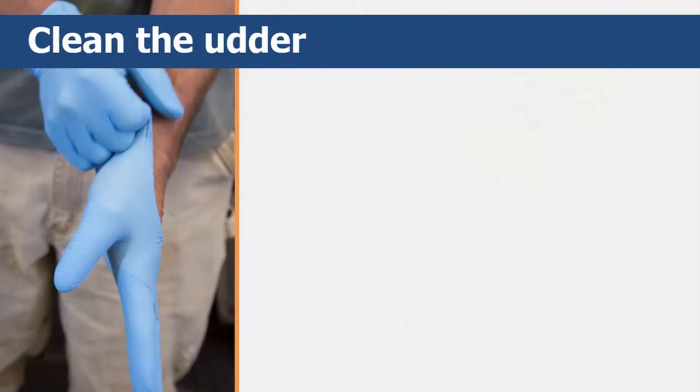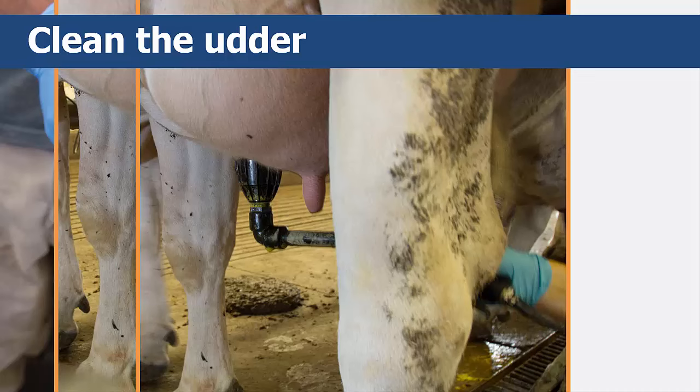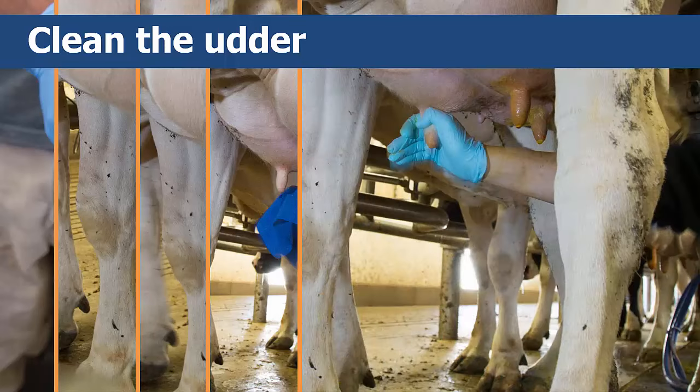Put on some gloves and clean the testing area on the udder using a clean paper towel to remove dirt and manure from the teat, which will help to prevent contamination. After that, squirt several streams of milk from each quarter to make sure you are using fresh milk from the udder.